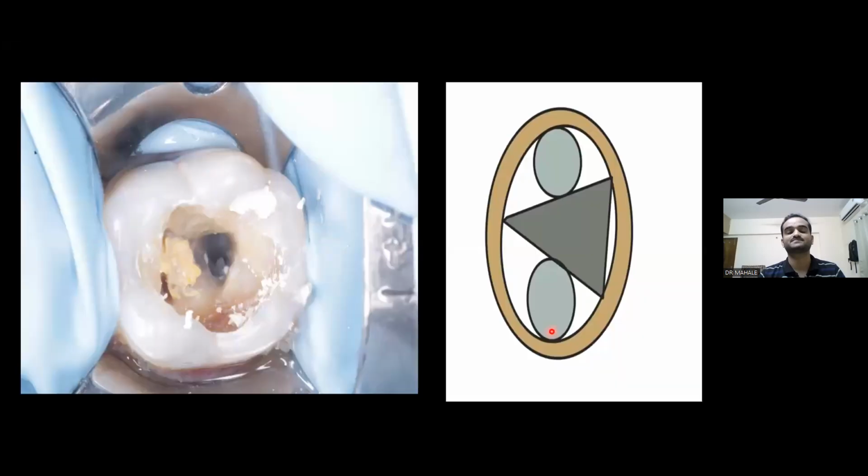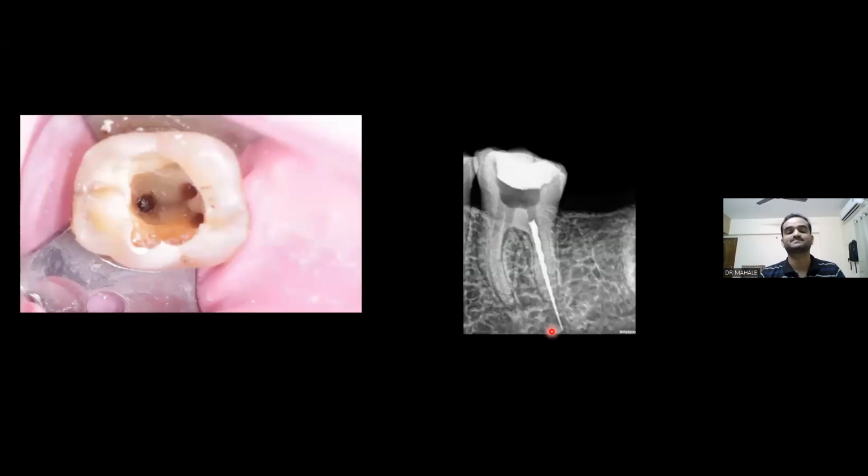Then that case instrument was retrieved and it was referred back for obturation. So this was, luckily, my next case. A long F3 file in a straight canal, 2 to 3 mm beyond the curvature, 2 to 3 mm beyond the apex, and originating from the coronal third of the canal. And seeing how much it has extended, you can guess it was referred from the UG clinic.